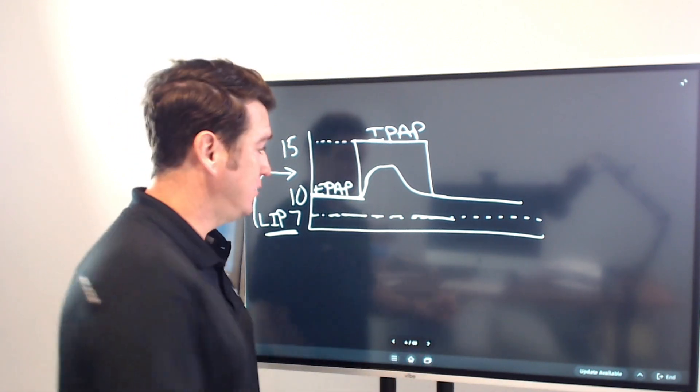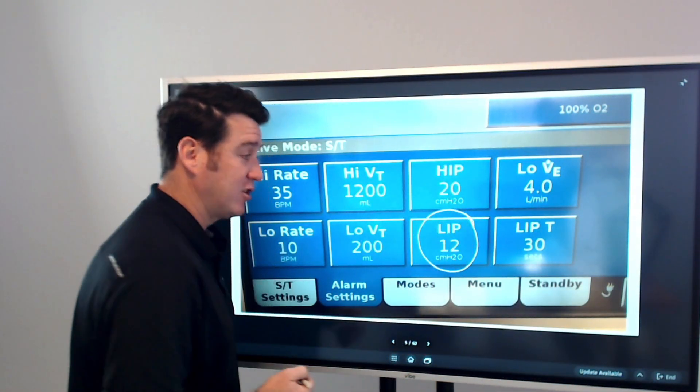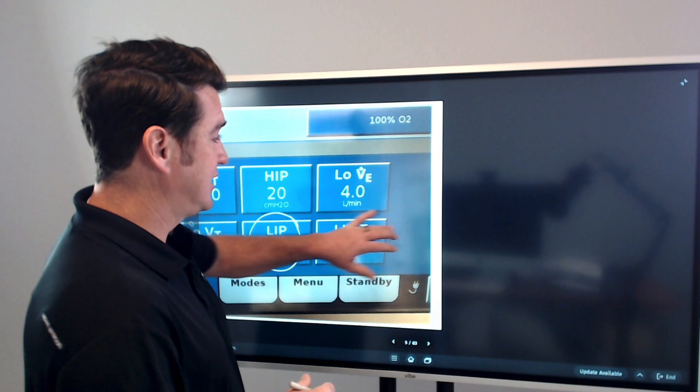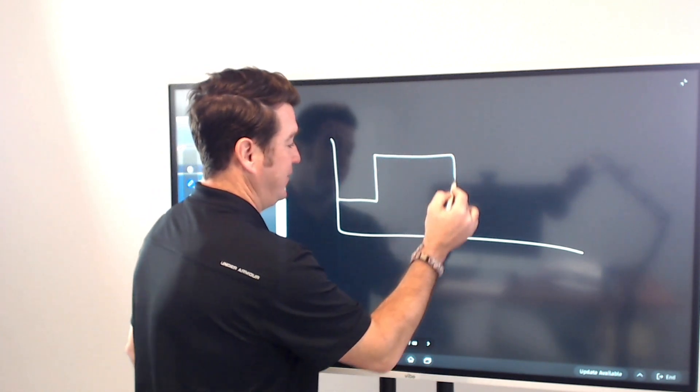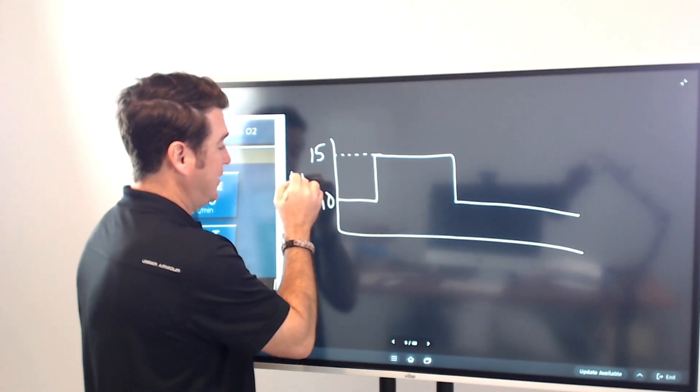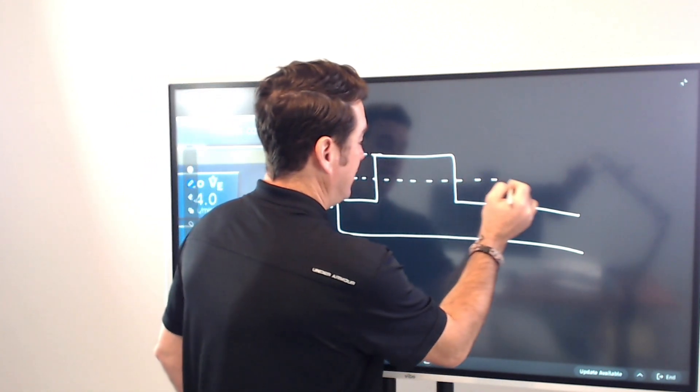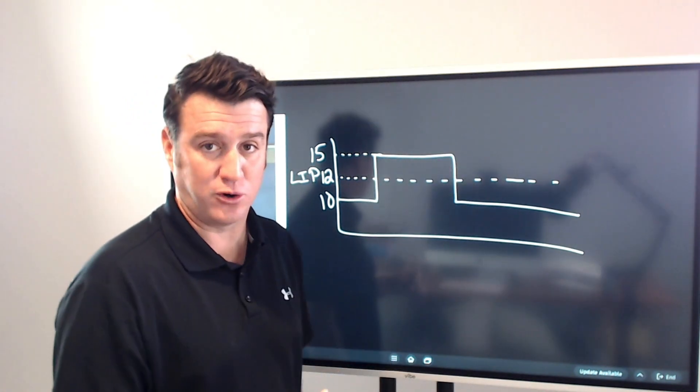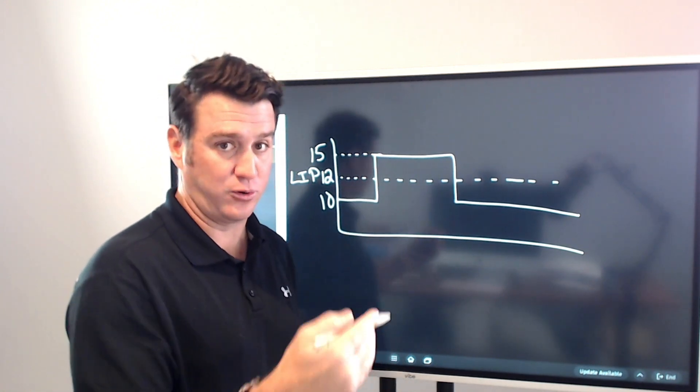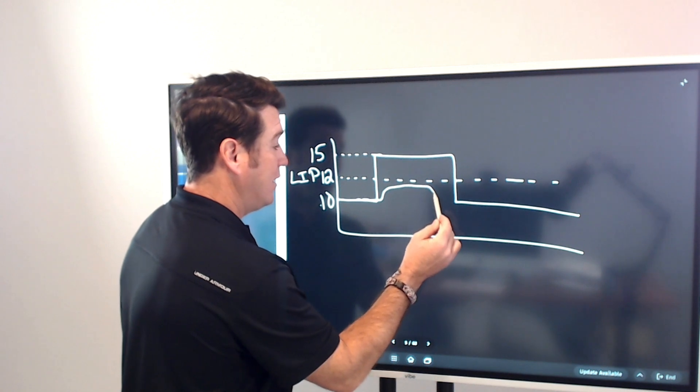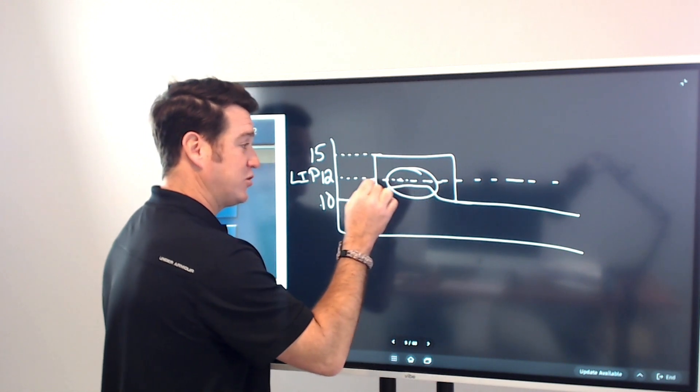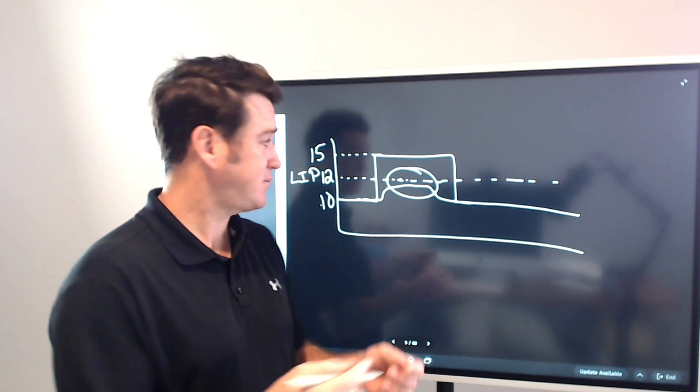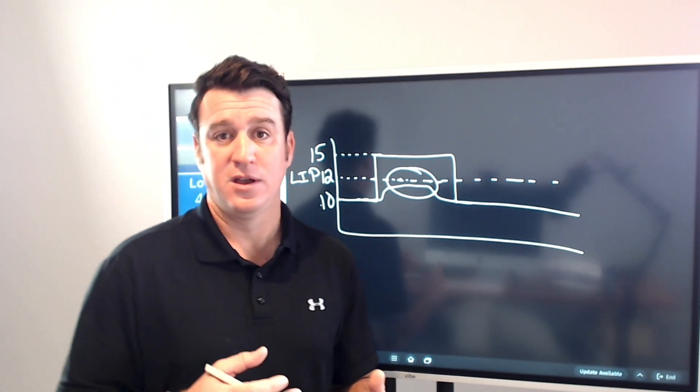So, what do we do? We changed it and we put our low inspiratory pressure alarm at 12. Now, remember, we're 10 over 15. EPAP of 10, IPAP of 15. We've got 10 here, we've got 15 here, and we put our lip right here at 12. Now, when the patient takes a breath and the V60 gives that inspiratory pressure, increases the inspiratory pressure or attempts to increase the pressure from 10 up to 15, if it fails to do so, then we will be notified because that low inspiratory pressure alarm was not reached. And now we have an alarm that is actually going to be useful for us.